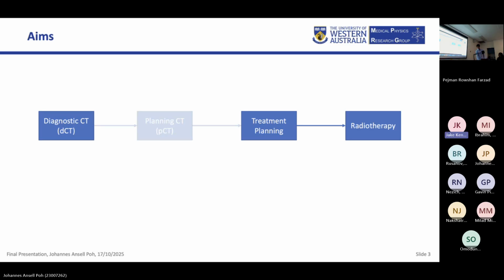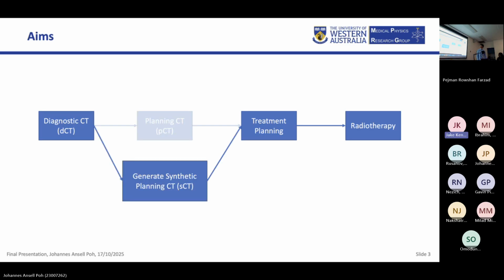The purpose of this project is to remove the need for the patient to undergo a planning CT and instead generate synthetic planning CT from the diagnostic CT, so the patient doesn't need to take that extra trip to the hospital for the planning CT, which is especially important for palliative patients living in remote areas that have to travel long distances to the hospital.